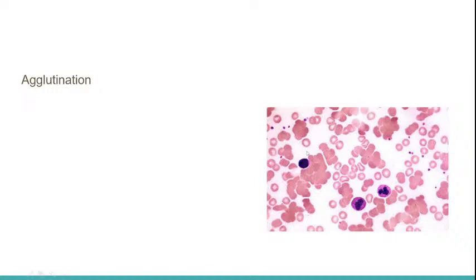Now, where would I see this? In the peripheral blood smear? You'll see this in the feathery edge. If you see this type of arrangement or cellular distribution on the upper portions of the smear, that means that it is normal, because on the thicker portion of the smear, you will see things like these. But if it's in the feathery edge, there's got to be something wrong with your sample. Either it's clotted or it's actually been agglutinated.